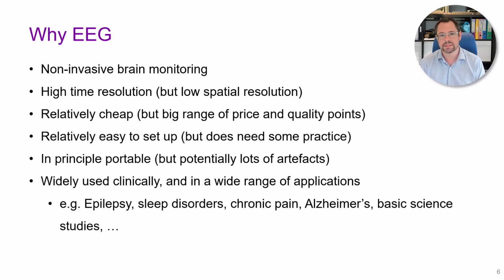In the clinic today, people presenting for epilepsy diagnosis or sleep disorder diagnosis would have EEG recorded quite routinely. It's used in basic science, for studies of Alzheimer's and chronic pain, as we're interested in here. That means there's a huge amount of literature, of tools, of different instruments that we can use.